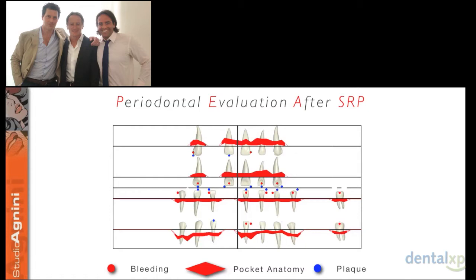And of course, it was not easy, especially because of the splinting in the inferior arch. It was not easy for him to keep clean, because there were a lot of undercuts, so it was not easy. Also, it was not easy for him to keep his work clean.